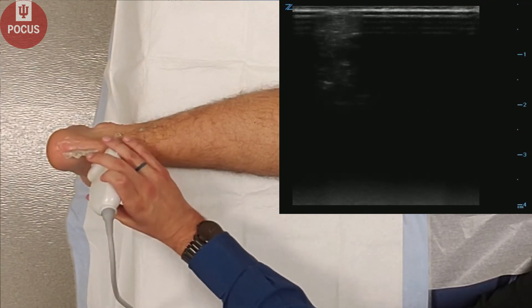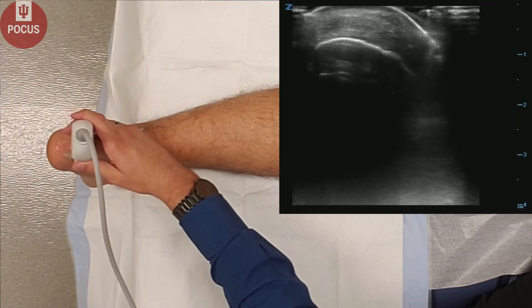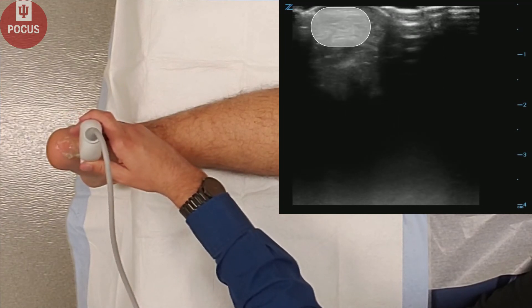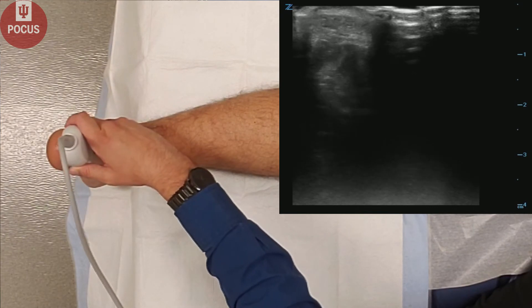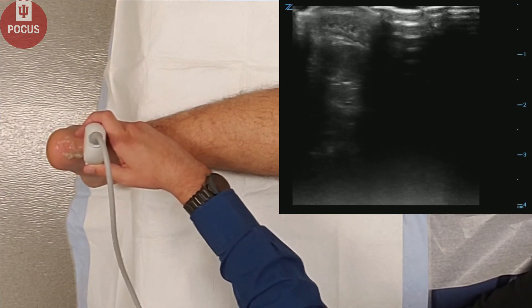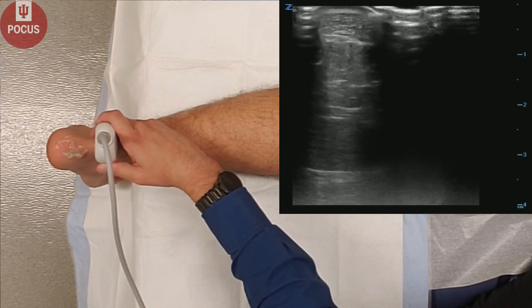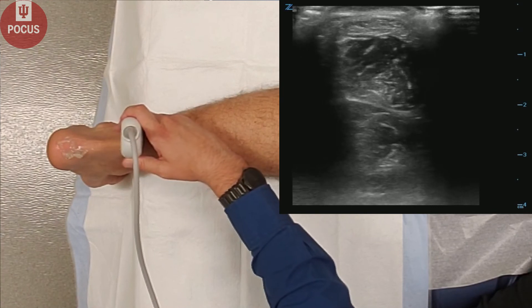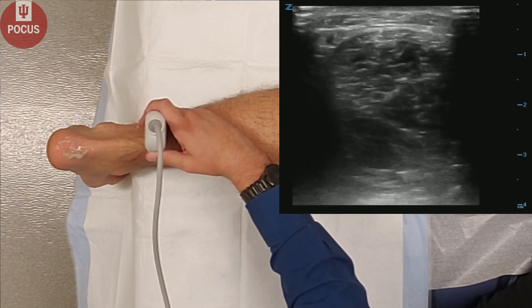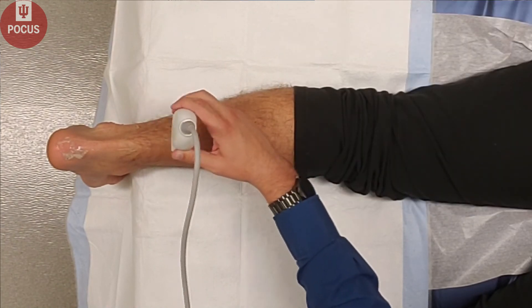We also want to make sure and evaluate the tendon in short axis. So we'll look transverse at the Achilles tendon here as it comes off the calcaneus. We can wag the probe back and forth to visualize anisotropy again, and we'll follow that tendon proximally looking for any disruptions or tears within the Achilles tendon as it transitions to the myotendinous junction.